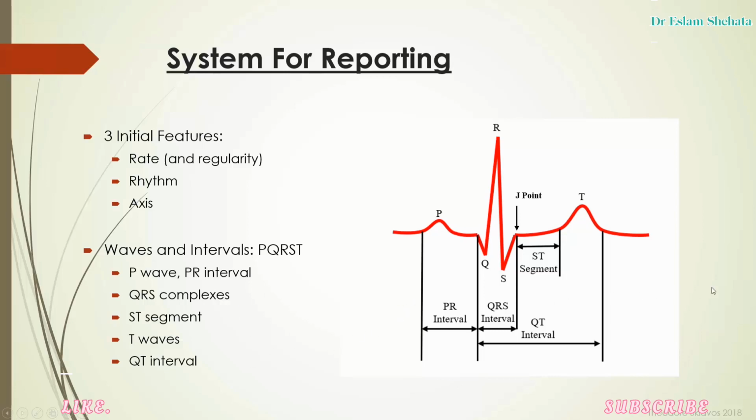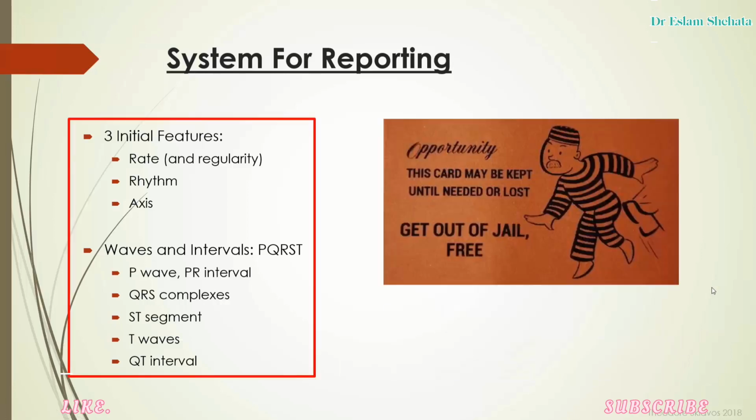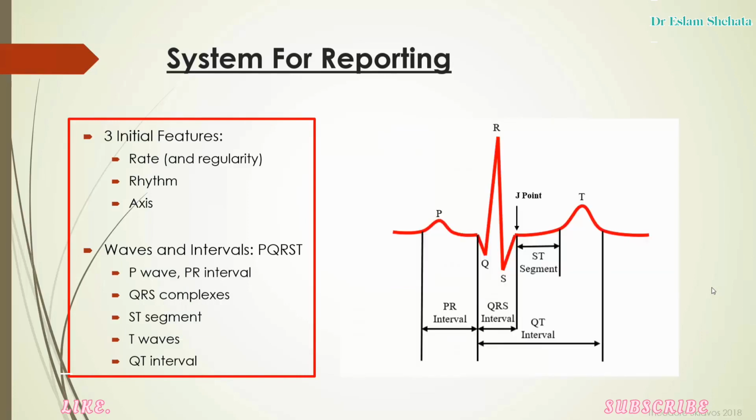Now, if you have a system like this, it really is your get out of jail free card, because even if you have no idea what any of it means, as long as you can describe the abnormalities to a more senior doctor, they'll be able to help you out. Now, this lecture will go through these things one at a time, so let's get started.